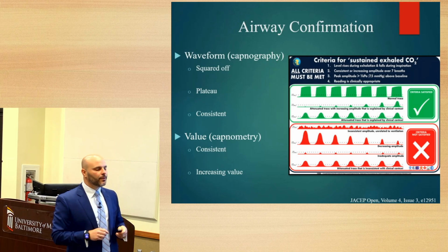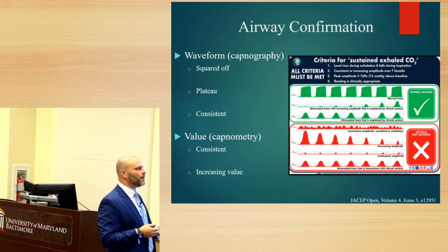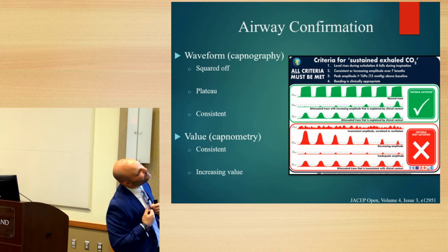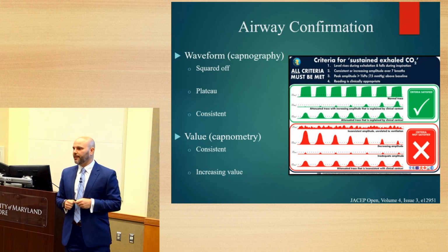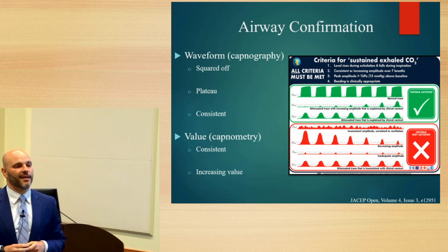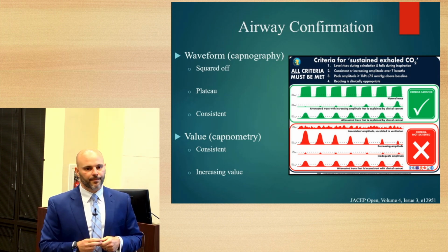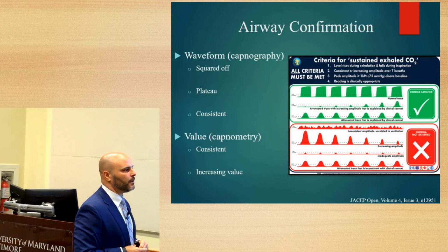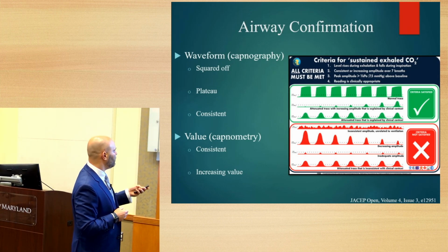Okay, what we want to do is, again, look not only at the capnometry, the number, but also the waveform. And there can be some false reassurance if people use colorimetry, so the color changing after you intubate, turning yellow after a couple breaths. There have been some false positive results in the esophagus from pre-medication, pre-bagging, and you could be falsely reassured. And then later on, find out that it's in the wrong spot after the patient desaturates or has a bradycardic event.